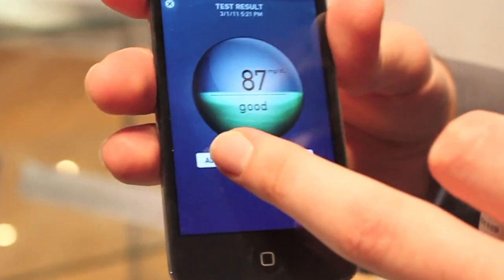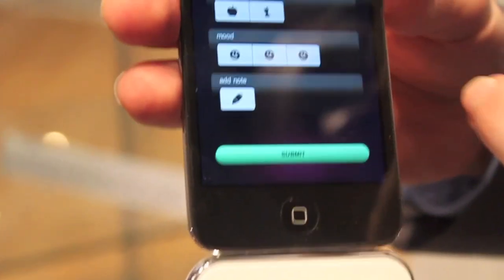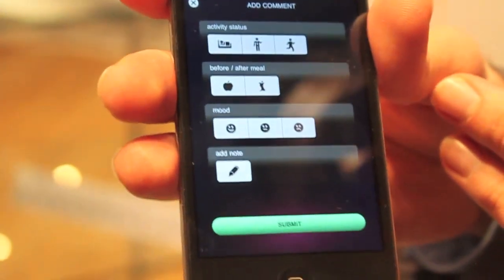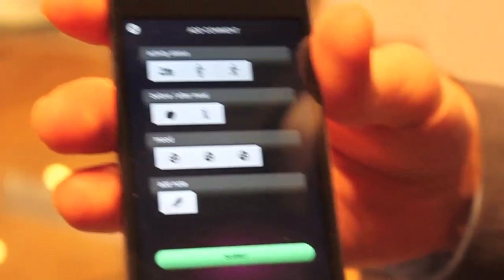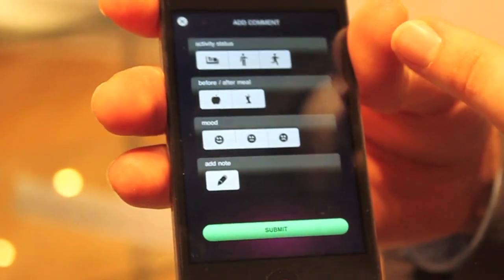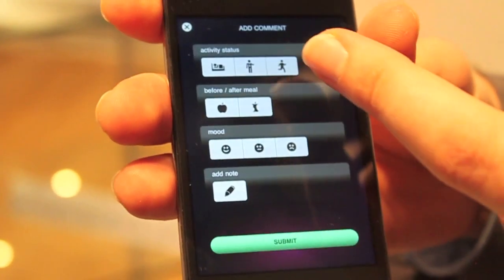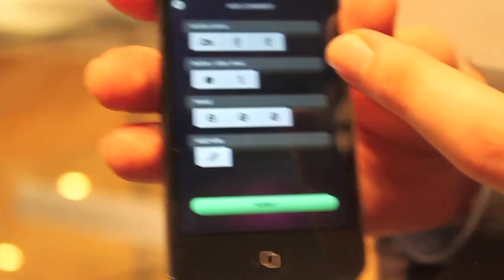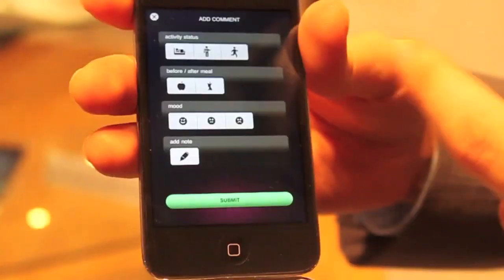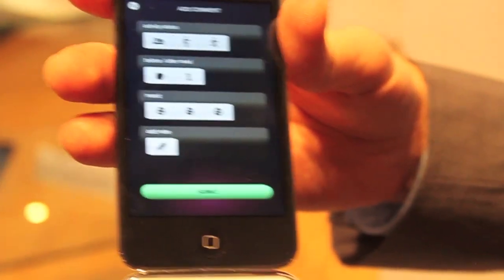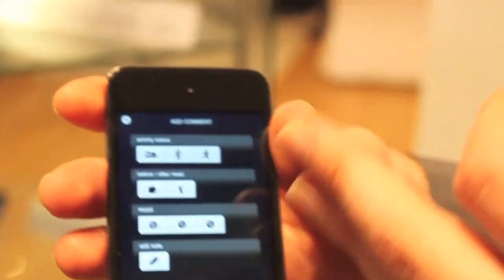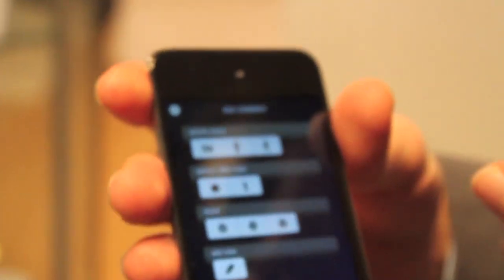Now users can add additional information about their activity status, meal, and mood. The first two are very important for diabetes patients, since they need to manage their therapy depending on their activity and food.